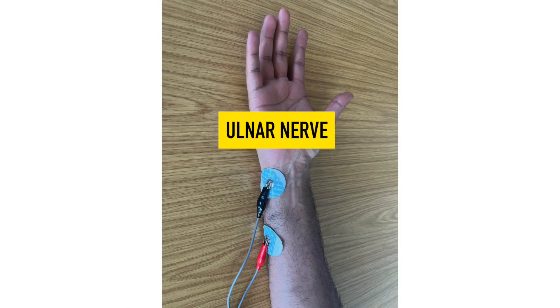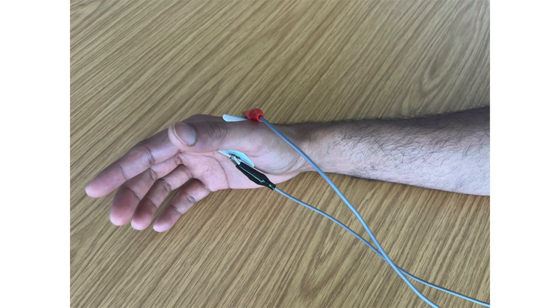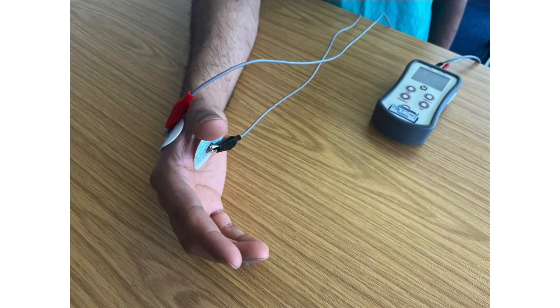The ulnar nerve: the leads should be placed either along the medial aspect of the distal forearm, over the sulcus of the medial epicondyle of the humerus, or on the hand by placing the negative electrode onto the palm between the base of the thumb and the second finger, and the positive electrode in the same position on the dorsal side of the hand.